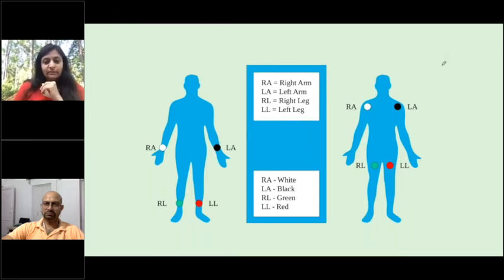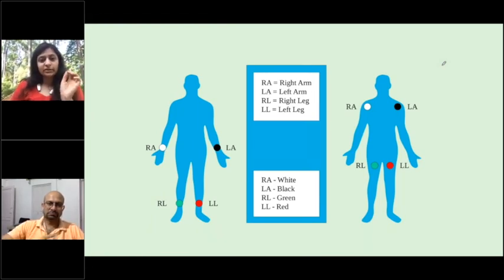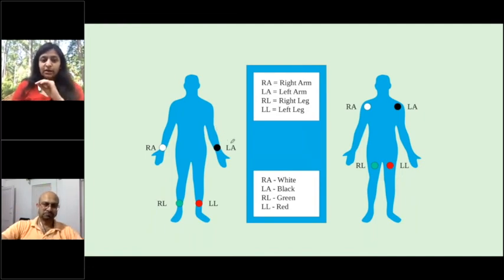And then coming to where we place these leads, okay? So we were talking about frontal planes. The basic concept of all of these leads is you're trying to make the electricity flow from a negative area to a positive area, okay? So all you're doing is the electricity is flowing from a negative side to a positively charged lead. So what you do is you put 4 leads. One is an inactive lead, which is your right leg.